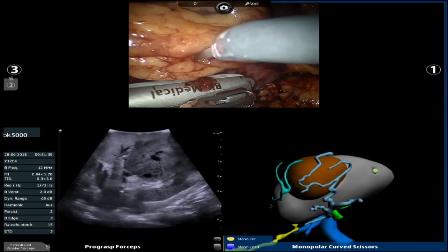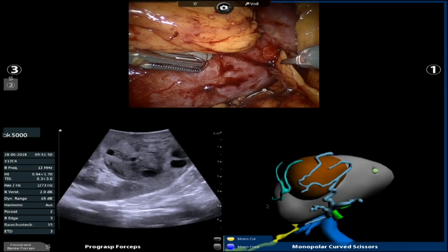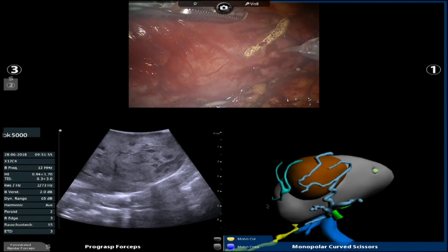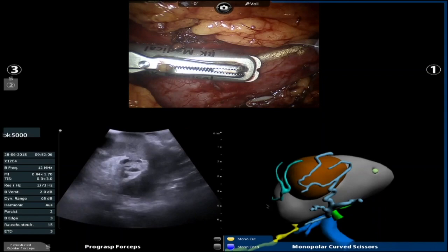Brandon, push in the probe a little bit. Push in a little bit. I want to change the angle. Perfect. So now I'm going to pull back. So there's normal kidney, and then the tumor's right there. You venting? Good. Thank you. So all I'm doing is I'm on the tumor. There's tumor there, and I come off, and the tumor's gone right there. So right about here.